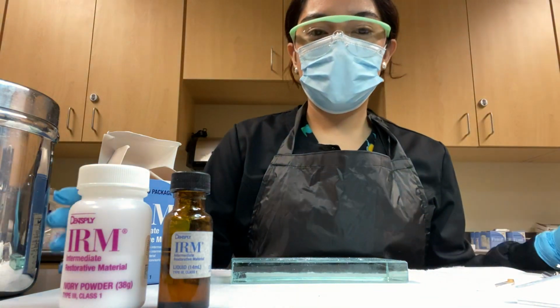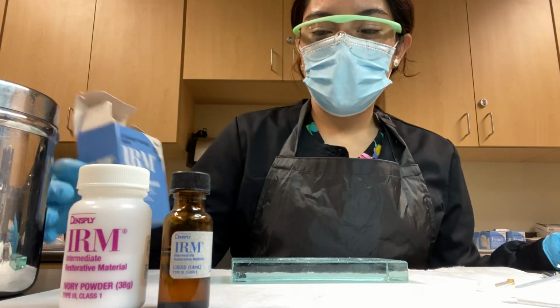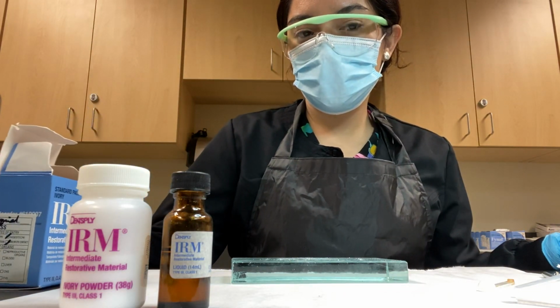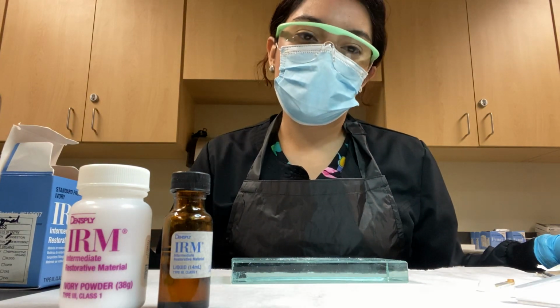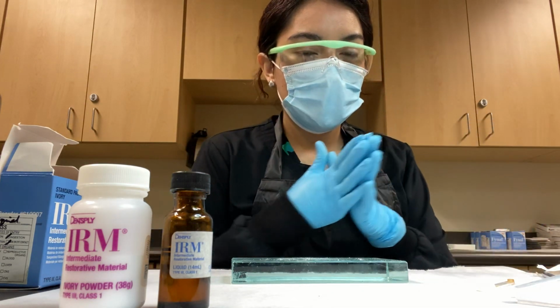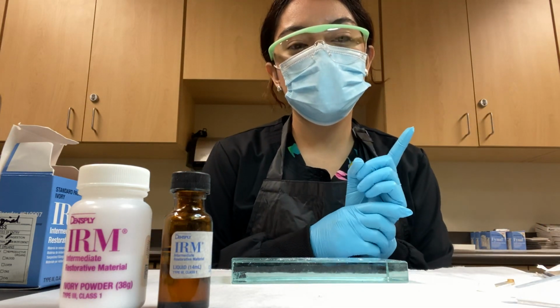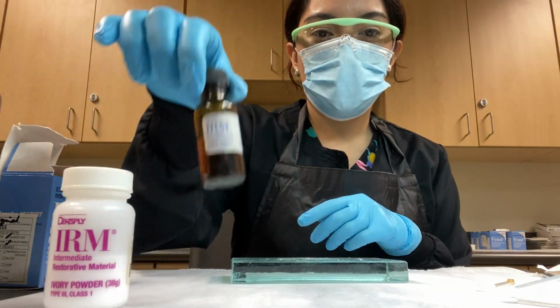Okay, today I will be mixing intermediate restorative material, which is IRM. It is typically used for like a cavity preparation or restoration, but it only lasts up to 1 year. My mixing time will be 1 minute, and my ratio will be 1 scoop of this and 1 drop of this.